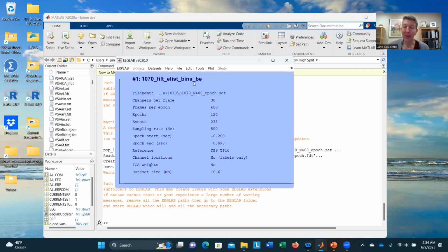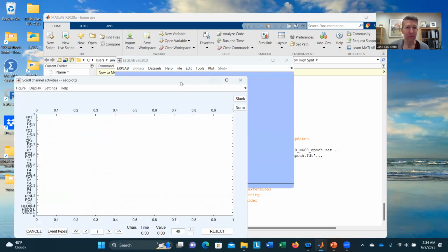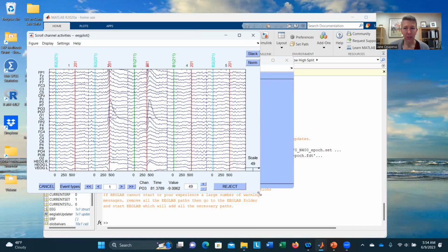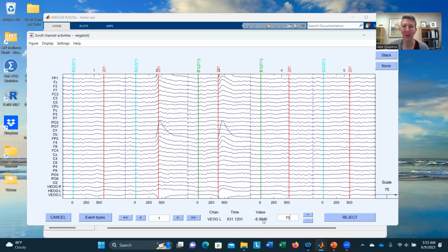In the little theory portion, I talked about the automated ways we can look for artifacts. We can also do that by hand. I am going to show you that as well. So how we would do that is we'd go ahead and plot our data using channel data scroll. And what we'll do is we will go through and look at our data. First, you want to set the display size, right? You don't want to do too small or too big. So you want to see your data at a nice range. And then you're going to walk through your entire subject's data, looking for artifacts, and you'll have to make a decision. So for example, in this particular window, we see that there is a blink here. I know it's a blink because it's a big up and a big down between my FP2, which happens to be above the eye.